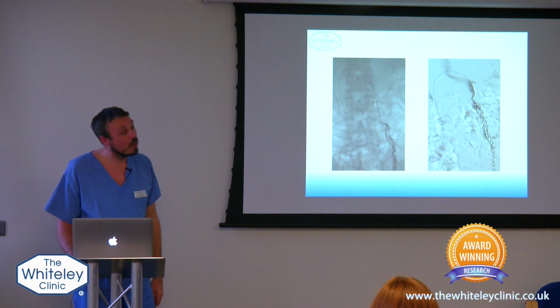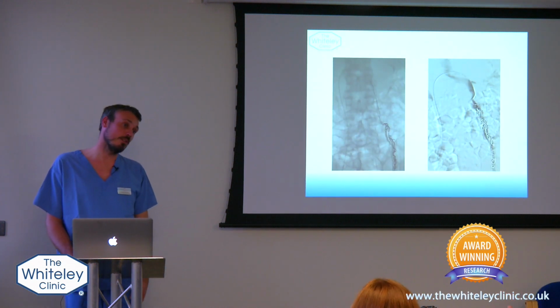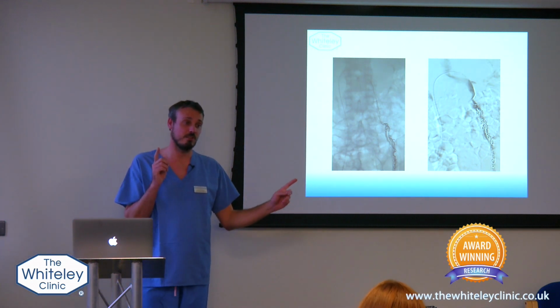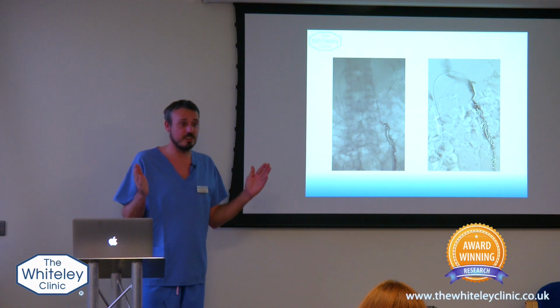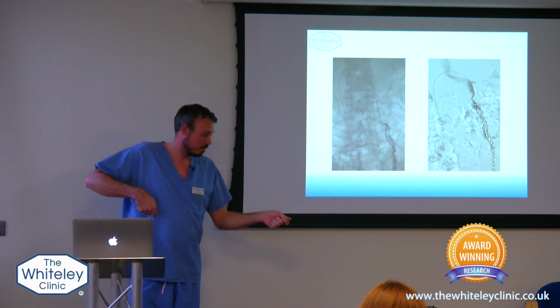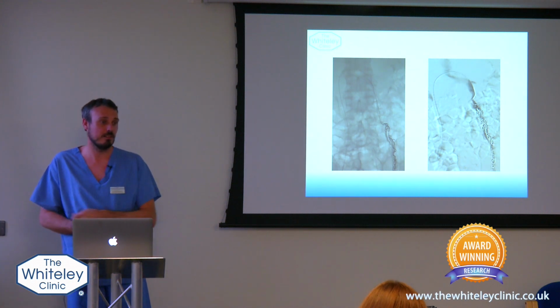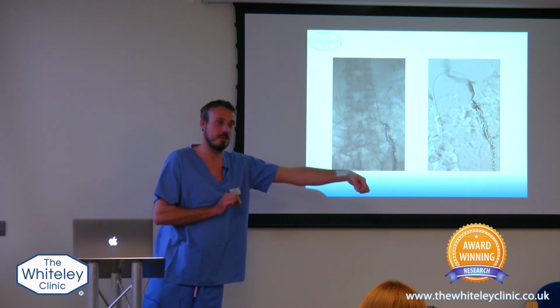Did it say that was 40 centimetres long? Yeah. So the coils are 40 centimetres long, and I can make it look however I want. Obviously, if I just push the coil straight out and pull the catheter straight back, then you'll just get a long bit of metal.